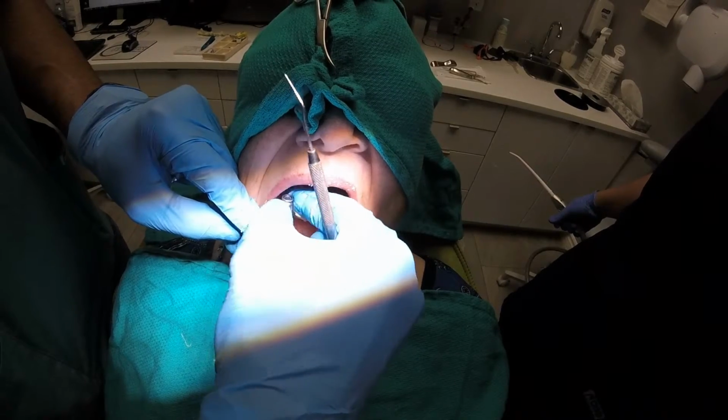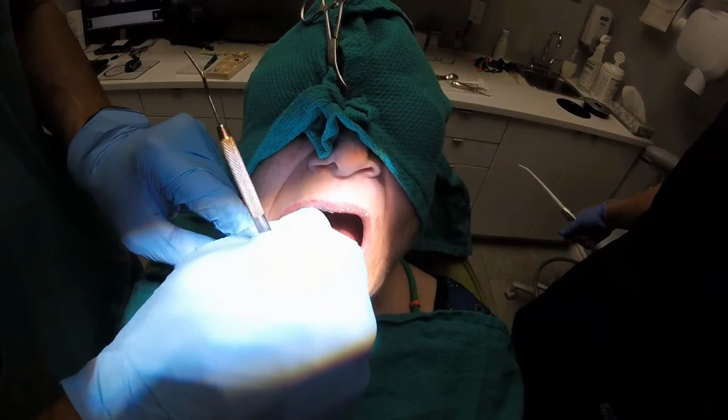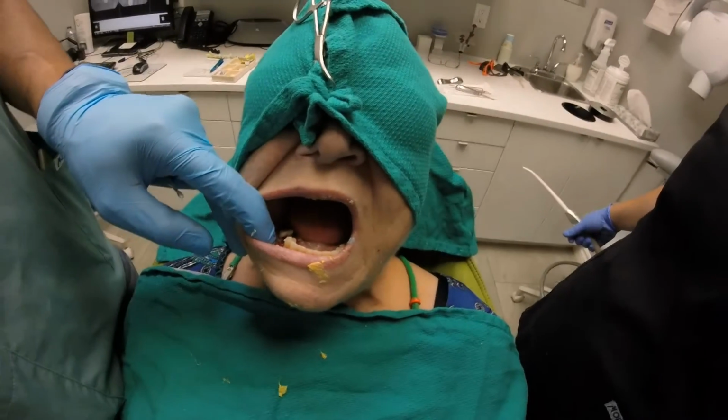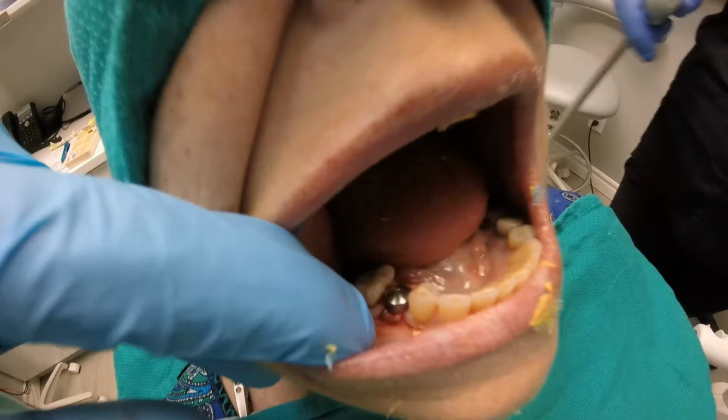Now, it's very important. Some clinicians, what they actually do is they just do the H incision and put the healing abutment on. I like taking my impression at the same time, but what's very important to do is make sure that when you do take this impression, you let your lab know that you didn't really give it a healing time. In the anterior, I'll always just put the healing abutment on, let it heal first prior to sending it off to the lab.